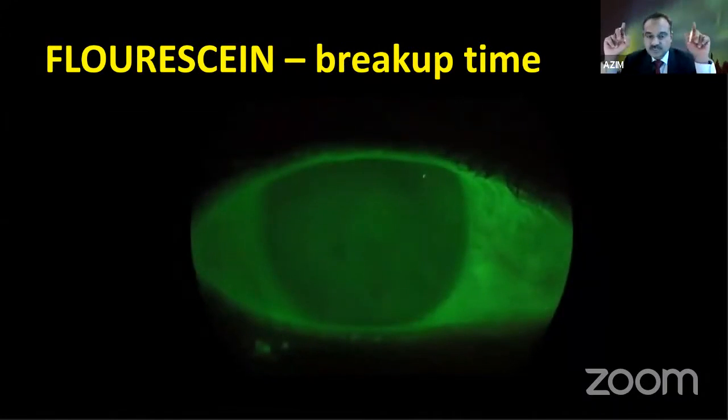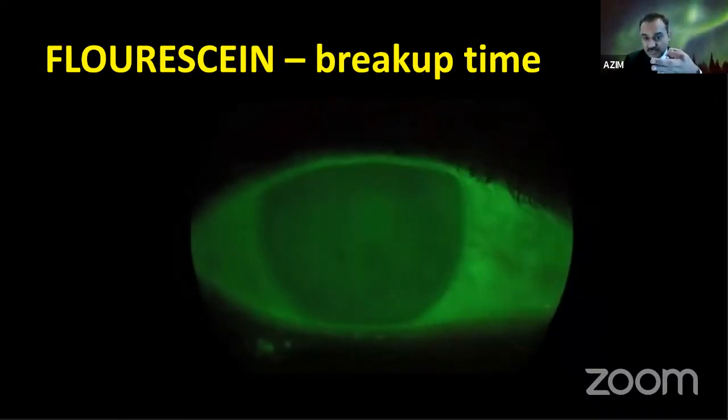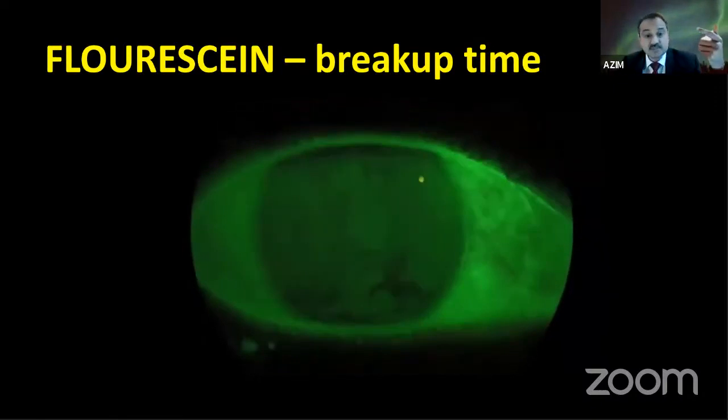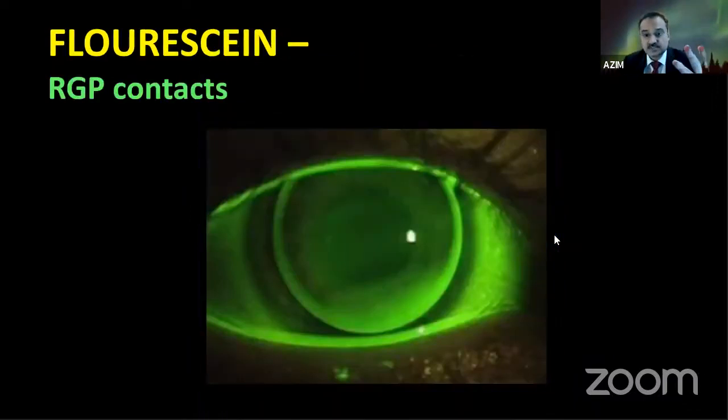So the purpose of fluorescein is to assess the tear structure, tear integrity, tear breakup time, and the tear flow. All right. So this is tear breakup time for you, one of the uses. Sometimes some irritation can be there. You can use a stain to see where the subtle changes in the cornea are. And for contact lenses also, you can put a contact lens, and this is where you can see the film under the contact lens when it's blinking.